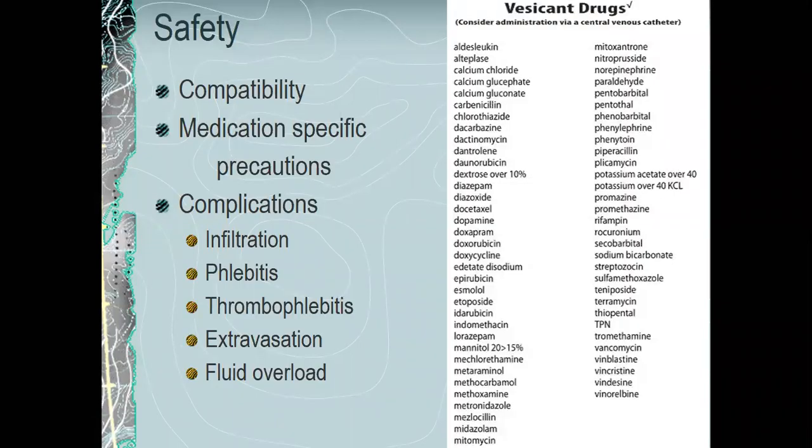Okay, so let's talk about keeping our patients safe while administering IV medications. First up, as I said, always, always, always check compatibility. Always, always, always follow medication-specific precautions. Complications when administering IV fluids and IV therapy at the IV site. And we're going to look at each of these separately.